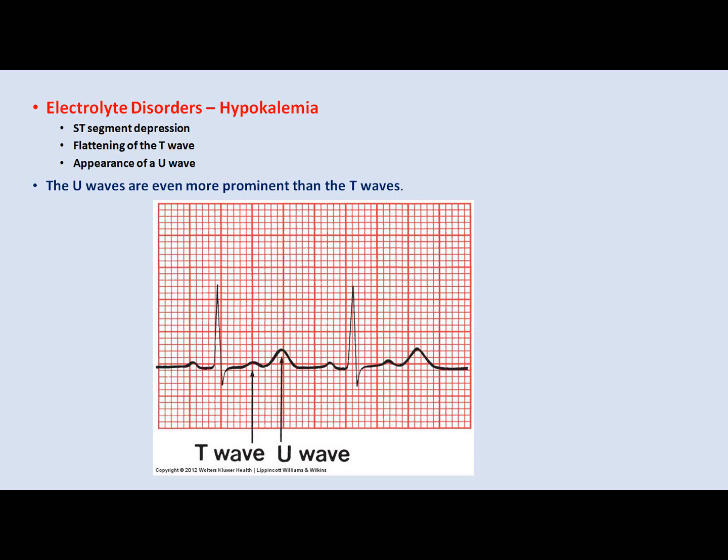And I had two brothers who came, they could walk. They were only like 20 years old, 20, 21, 22 like that. Both of them, hereditary. Potassium was 2. Usually after a heavy meal. I can't remember that, but anyway, potassium was 2. So you gave potassium, and they got up and walked home. You know? So you do an ECG, and this is what you see in ECG with low potassium. Okay.